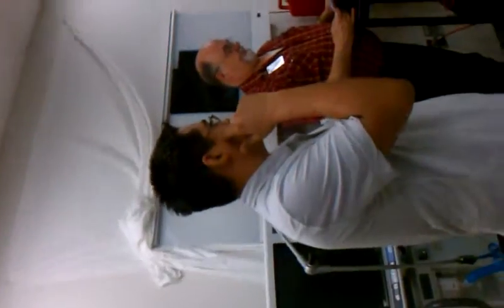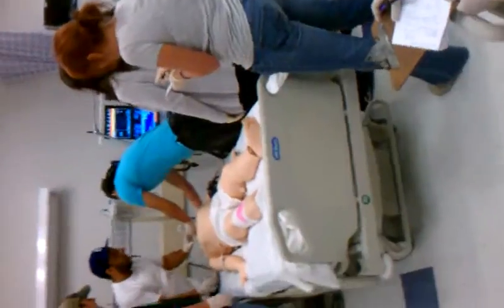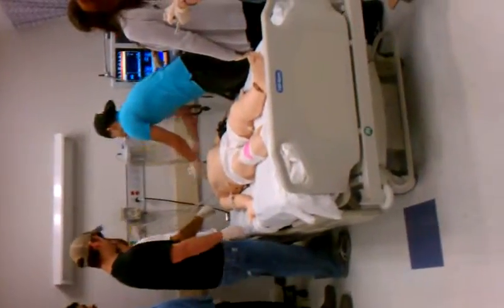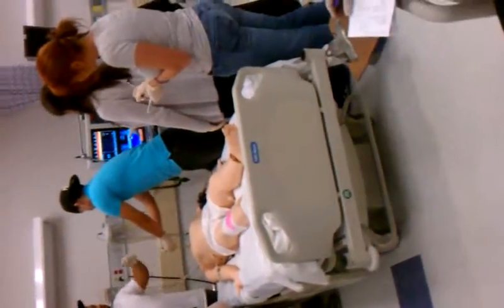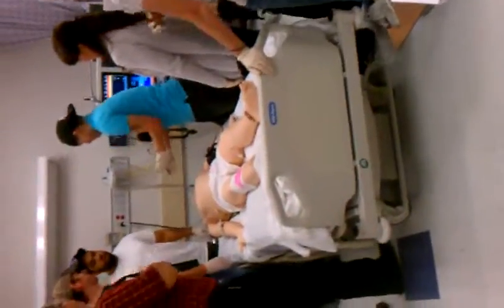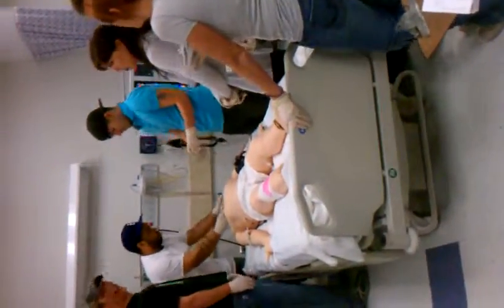How does that feel, Joel? That feel good? Suction. Yeah, suction, extubate, turn the ventilator off. Get all the air out. Cough. Good. Semi-Fowler. All right, so, shouldn't it be a little up, Sammy?